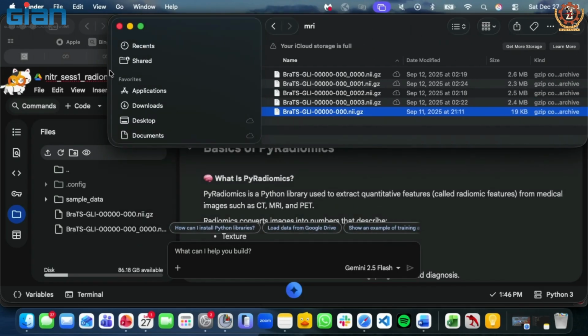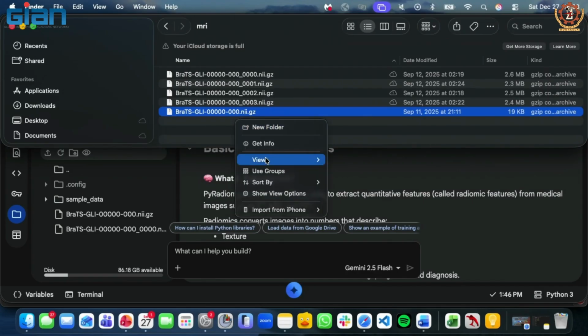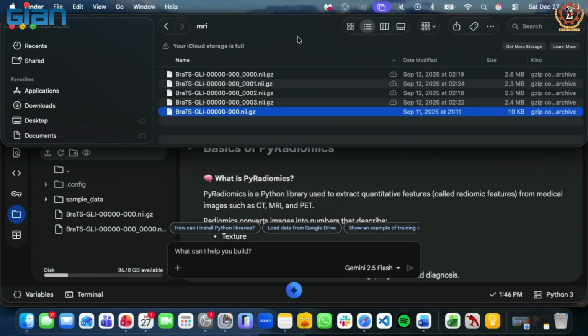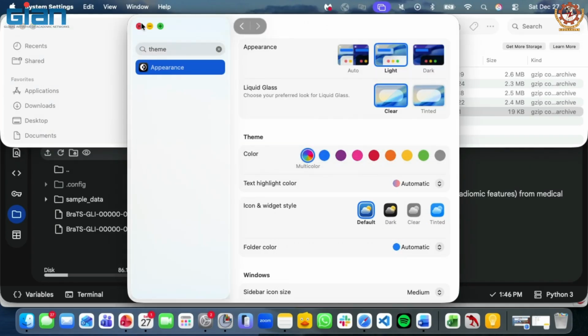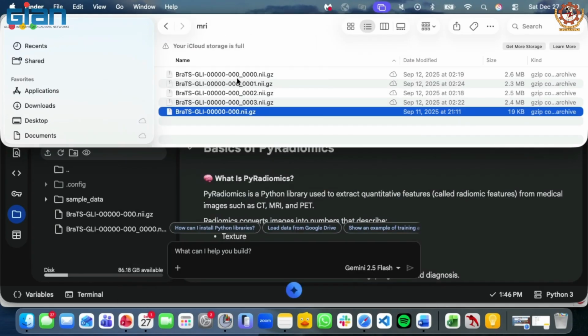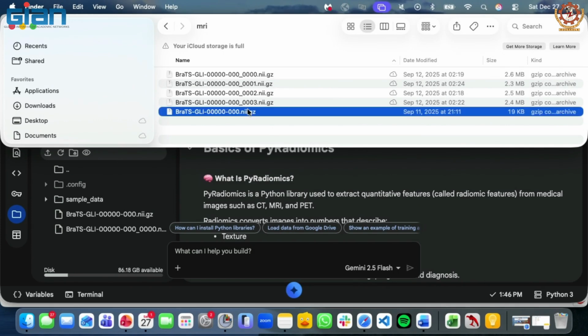Let me try to make the screen a bit bigger. Um, how about now? Is it visible now? Okay, finally I figured it out. So you'll have to just upload the first and the last file. Let me know when everyone has at least done this step, and then I can start.